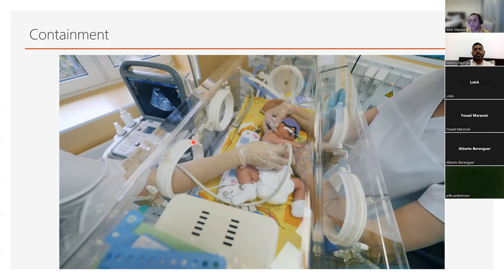Because if you're uncomfortable, and I cannot emphasize this enough, my job here is not just to teach you, it's to make you good scanners. What will happen is you will press hard. The more hard you press, the more the baby will fight. And it will try and move away from your probe. And what you'll get is a loss of contact. And really, if you have air between the probe and the baby, then you can easily think you might have a pneumothorax, you'll get a barcode sign.